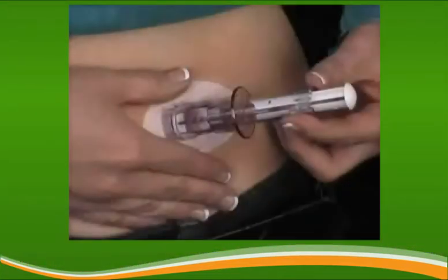In real time, the sensor insertion happens very quickly. Let's see how quick an actual Dexcom G4 Platinum sensor insertion can be.